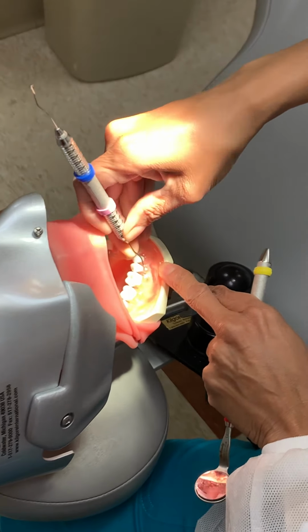Your fulcrum is extended there. You place it on the tooth, and you use your stroke up and down. And this is when you're going on the distal surface of the tooth. You come out. You start back at the distal line angle, and this is where you come across using oblique strokes. They're kind of diagonal strokes. And then you come mesial, you go into the mesial surface of the tooth.